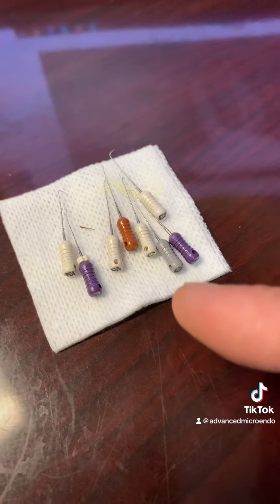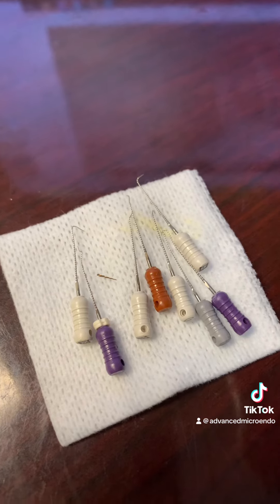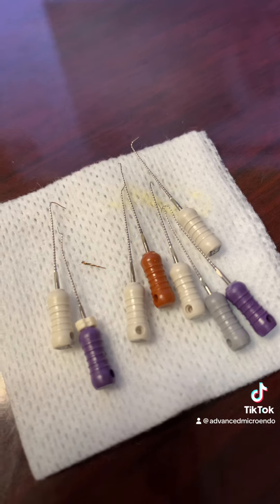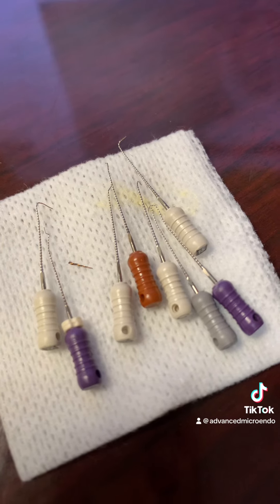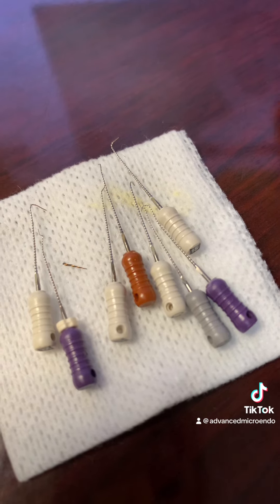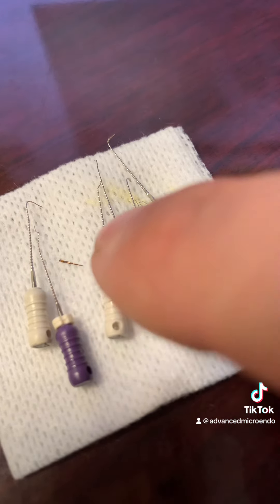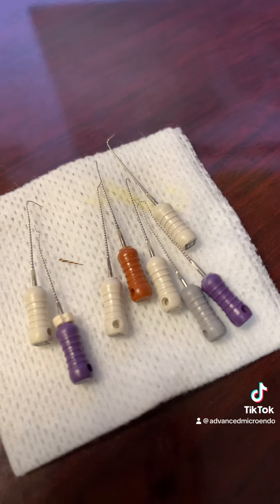I destroyed this many files, and even broke an orifice opener as you can see right here. But I was able to retrieve it — I didn't even use anything special to retrieve it. I just used hypochlorite, and because the two mesials joined, I broke it in the coronal part of the mesial buccal canal, then injected hypochlorite in the mesiolingual canal and the broken file popped right out of the mesial buccal canal.